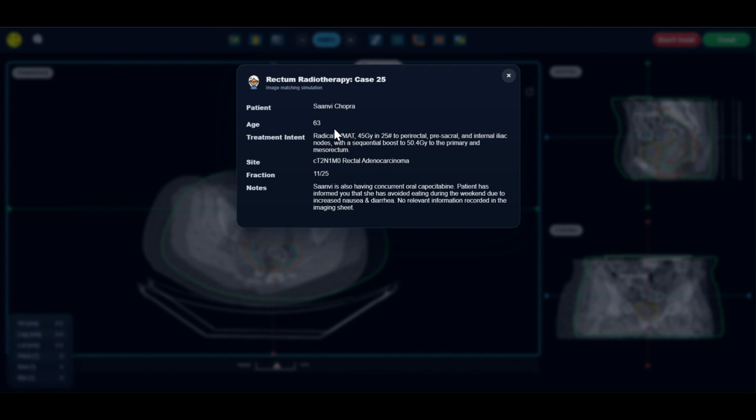Next, moving on to VMAT. VMAT stands for volumetric modulated arc therapy. Now, VMAT is a type of external beam radiotherapy where the treatment machine rotates around the patient while delivering radiation. And as it rotates, the machine can continuously adjust the shape of the beam, so that's the MLCs, to be more specific, and the dose rate and the speed of the gantry rotation change as the gantry rotates around the patient.